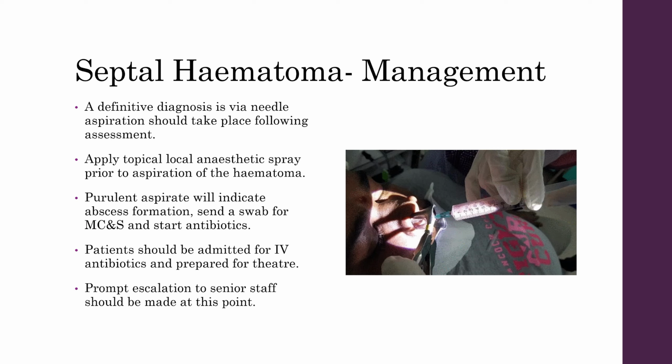In managing patients with septal haematoma, you'll want to get a definitive diagnosis, and this is done by needle aspiration, which should take place following your assessment. When doing this, you want to make sure that you apply plenty of topical local anesthetic spray.